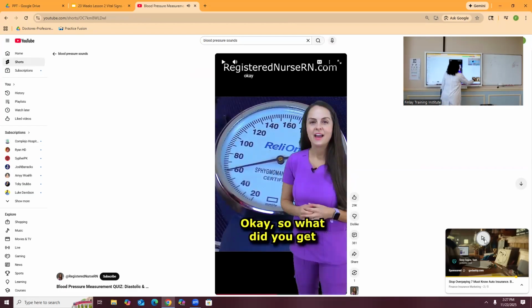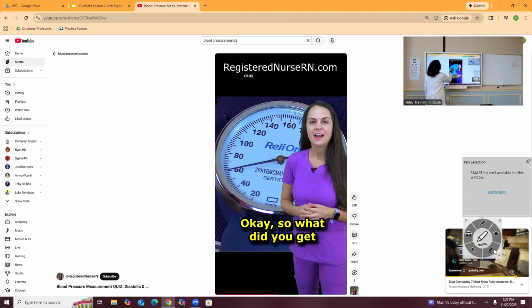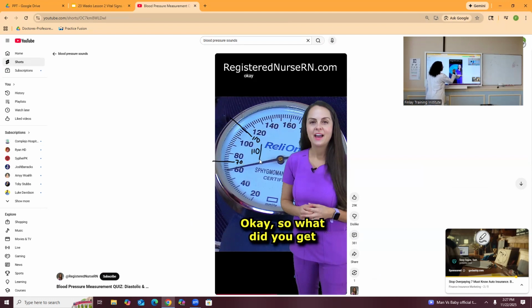Okay, so if you pay attention, the first sound was here, over here. So it's 100, 102, 104, 106, 108, 110. The last sound we hear was right here. So this is 60, 62, 64, 66, 68, 70. So that means that the blood pressure is first sound 110, last sound 70. Blood pressure is 110 over 70.